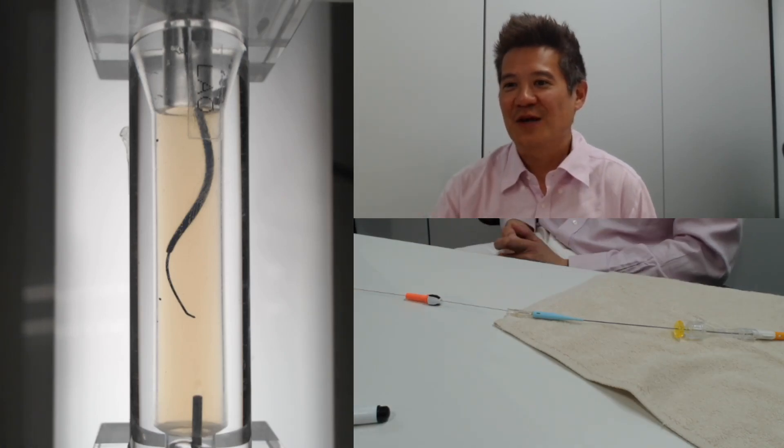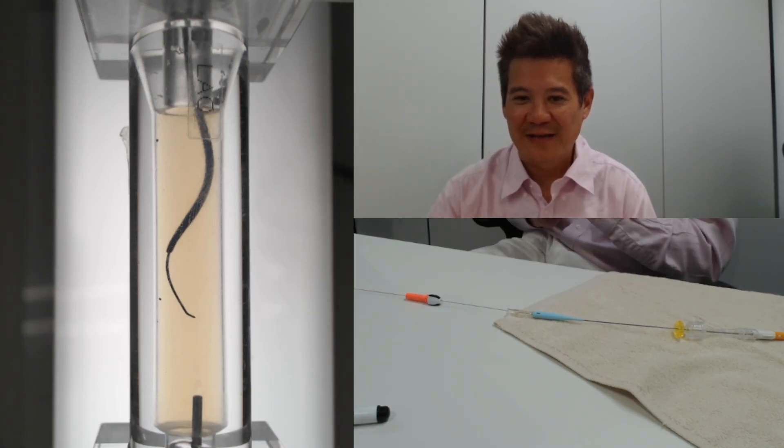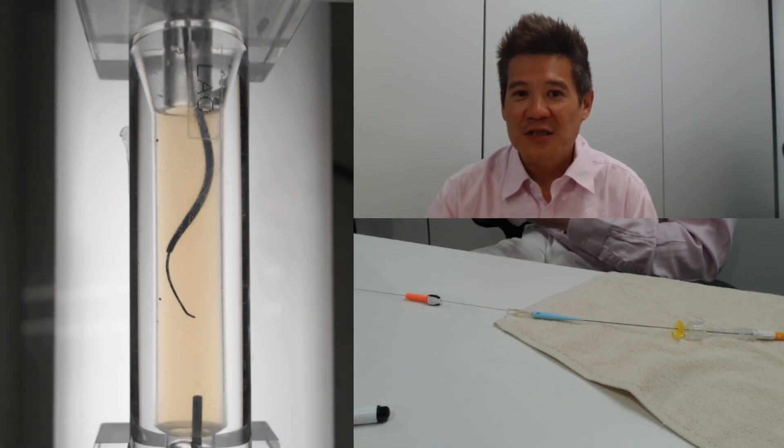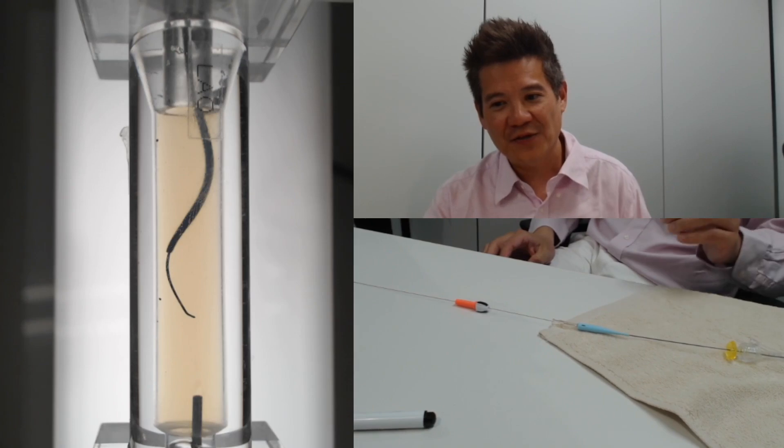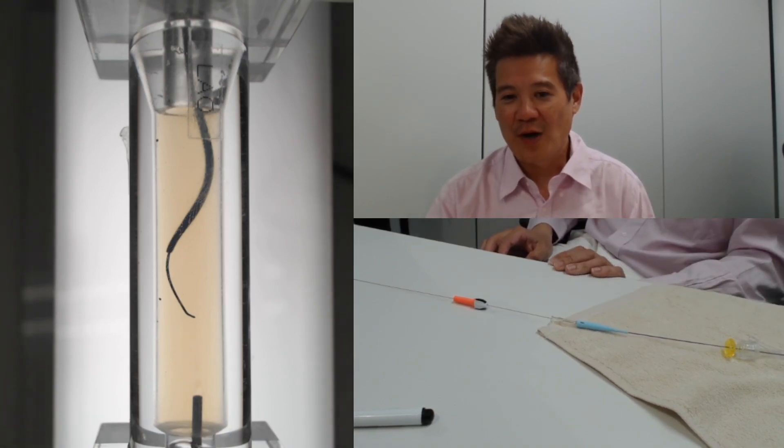Hi CTO Daemon channel friends, I'm CTO Daemon and I'm doing the CTO model from Asahi. Here we have a Corsair catheter and a Conquest 12 gram wire which is shaped with about one millimeter tip at about 30 degrees.